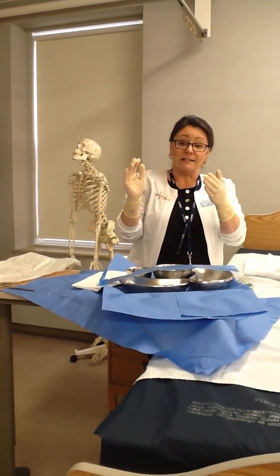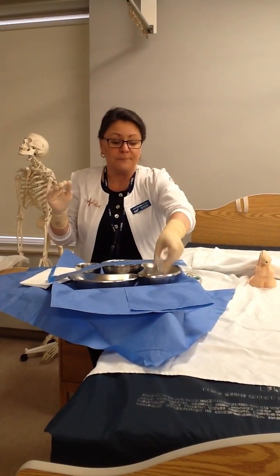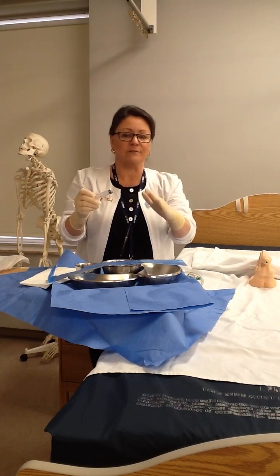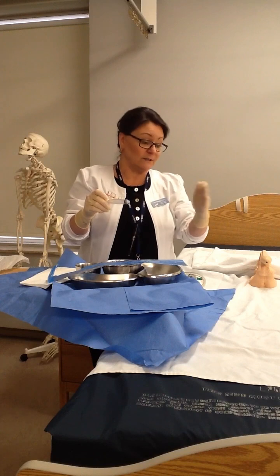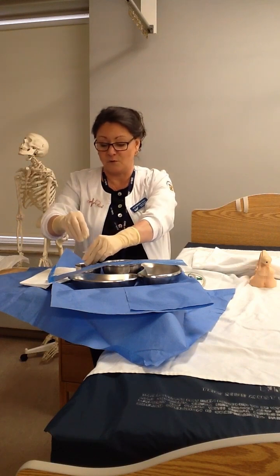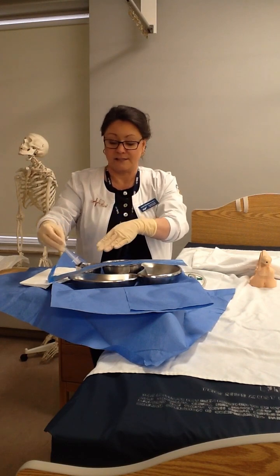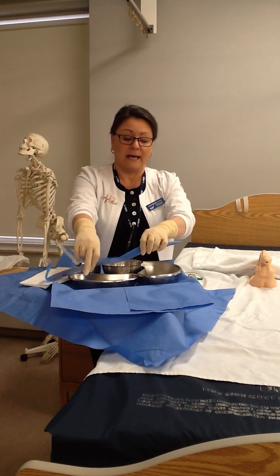And so now we're ready to start putting our stuff together. The first thing that I'm going to do is fill my 10 ml syringe. You can set up whatever way you want, as long as you remember to set up. Don't leave it until you've created your second sterile field. Just set this up first. So I'm going to fill my syringe with 10 ml of water, and I'm going to leave it sit right there. It's not hurting anything.